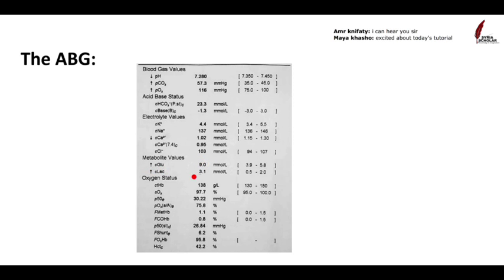And lastly, the lactate. And this is something that goes up when people aren't getting enough oxygen to their tissues, or if they're septic, for example, or they've lost lots of blood. It tells you basically how sick a person is. So this is another very useful indicator. But those are all things that you can find in lots of blood tests.